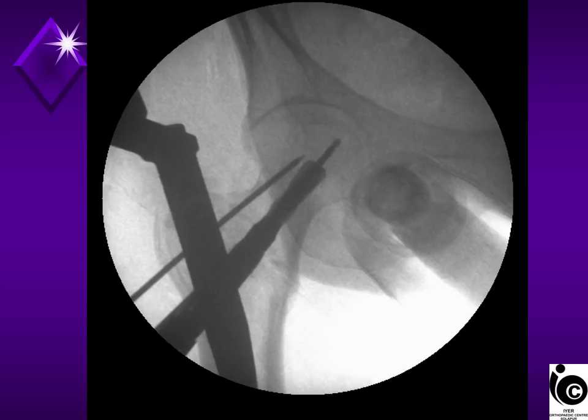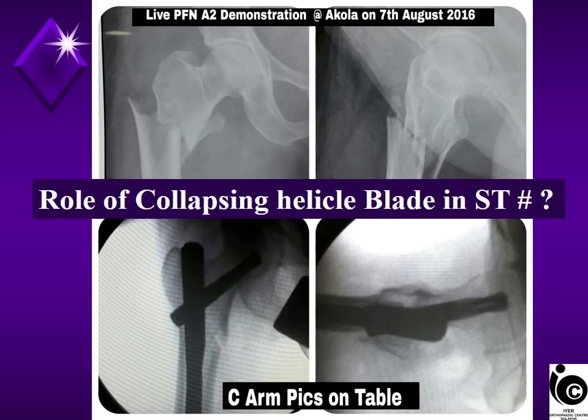Especially in a subtrochanteric fracture where you don't require this compression, if you use this implant, this is an inherent problem with it. Another problem with this implant is that it can allow only 7 mm of collapse. If your fracture requires 10 mm of collapse, you cannot have that much. If your fracture requires 5 mm of collapse, it compresses 7 mm. So, as I said earlier, a newer implant doesn't mean it's always better. They are in the market only for commercial reasons.